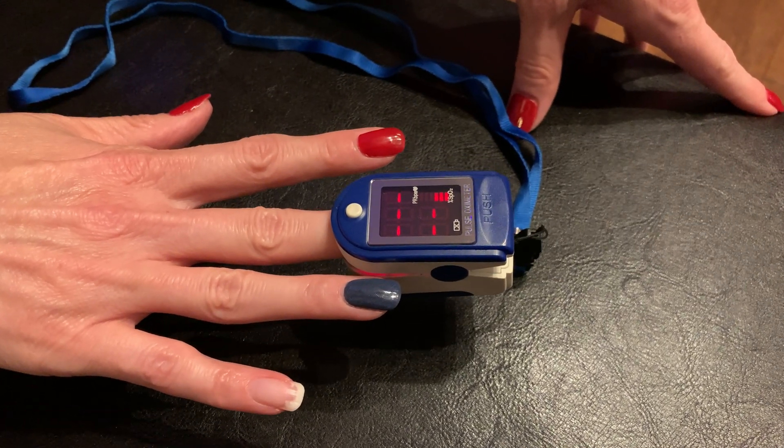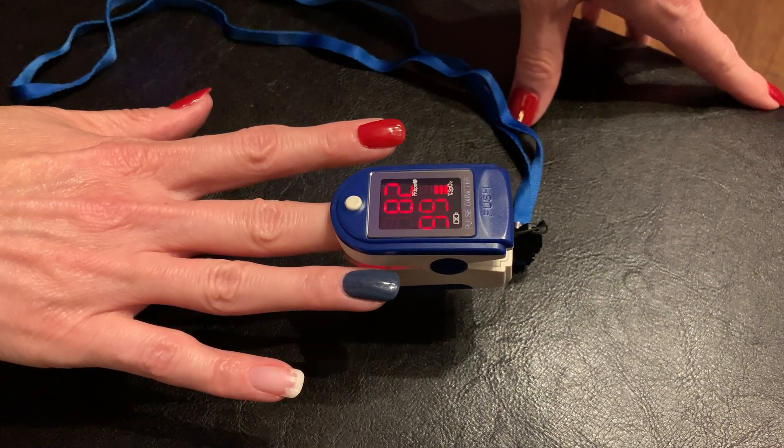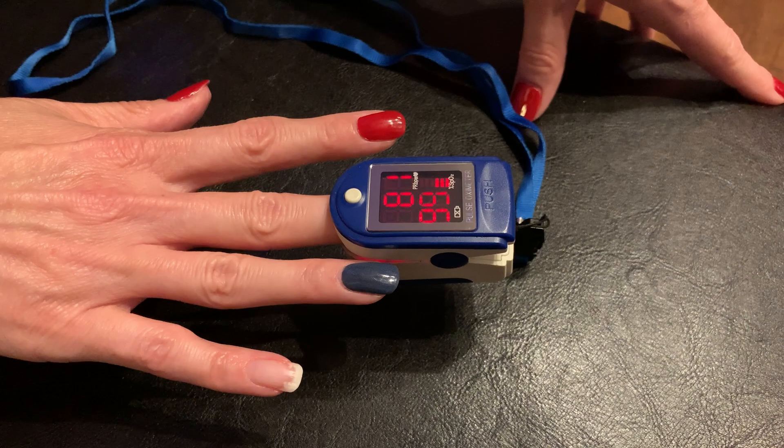On the white — being the absence of color, I think it would work fairly well — yep, didn't take long: 99%, pulse of 82.